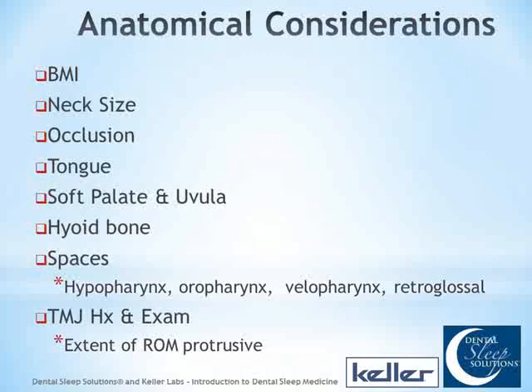Spaces. Rich, you can read these if you want to. Well, you're just looking at those. If you're going to do CT scans or some of the newer technologies, those are just the spaces behind there. If you're into that stuff, you can do it. We've talked a lot about TMJ and that type of thing. So I do want to just point out that people need to be able to move at least 5 or 6 millimeters probably before you can help them. So that's one of the things you want to look at.